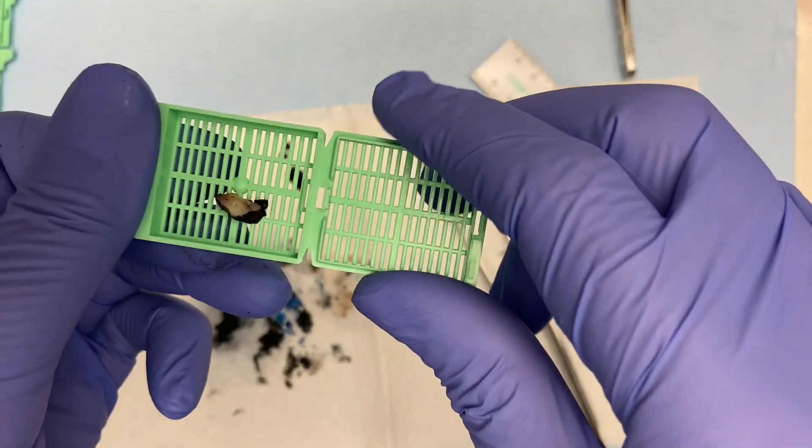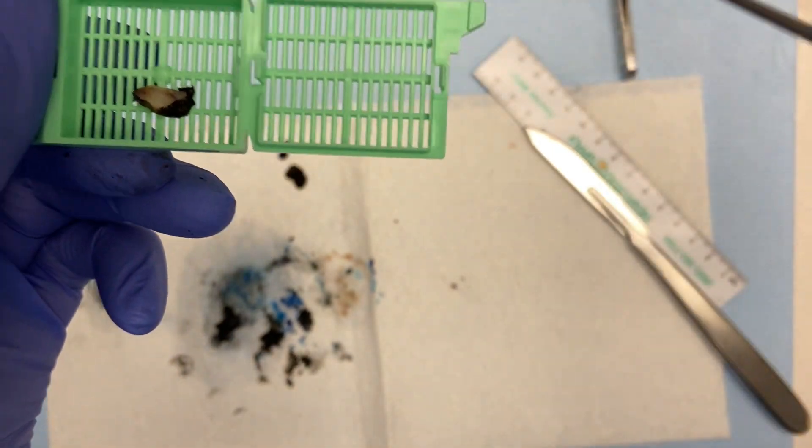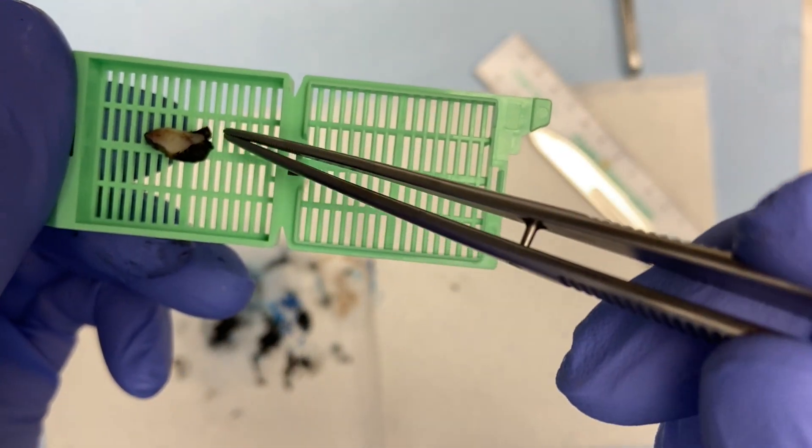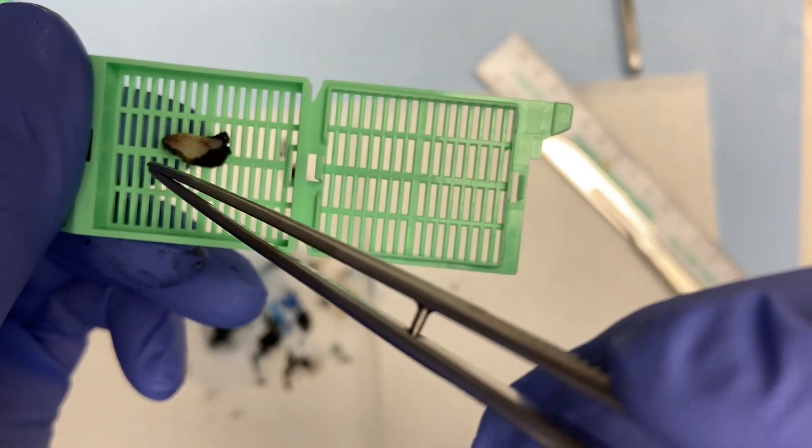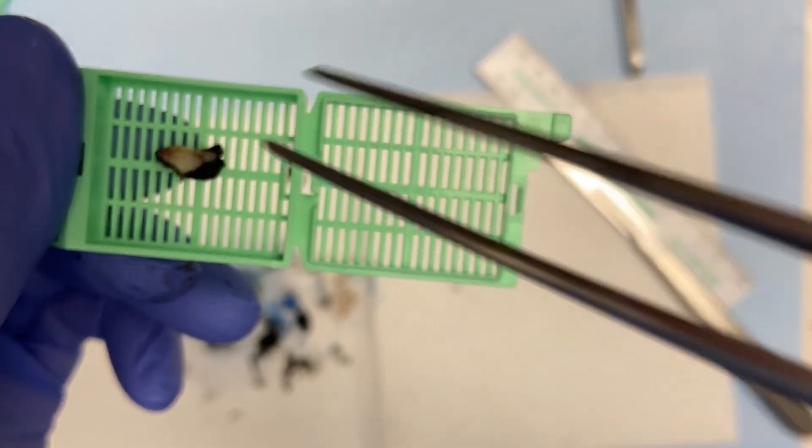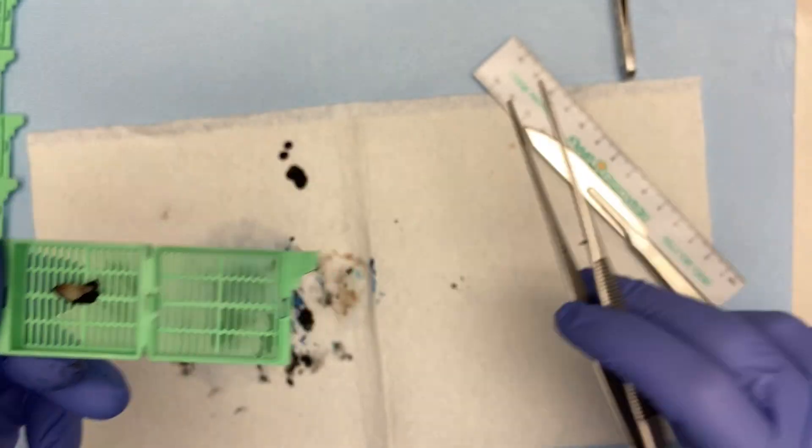The perfect section we're looking for is like this. It's black, it's blue, and it's mucosa. And that's how you do cervical LEEP.